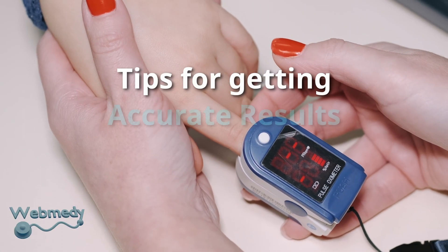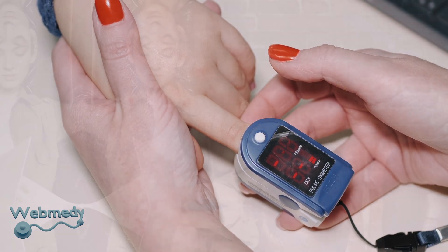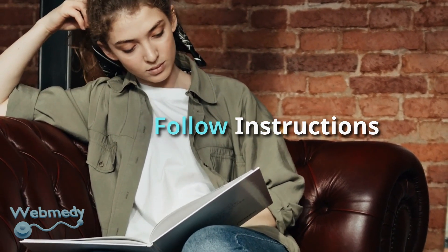In this video we will give you tips to get accurate readings from a pulse oximeter. Always follow instructions from the device manufacturer on how to take a reading.